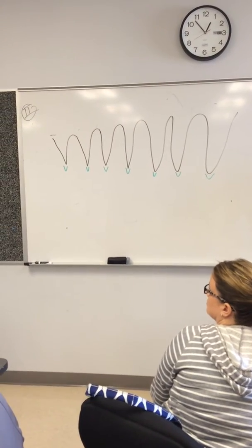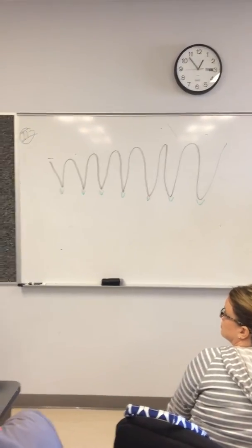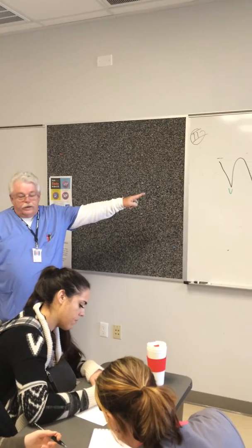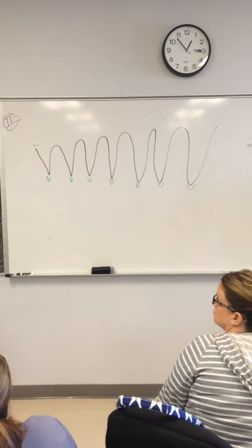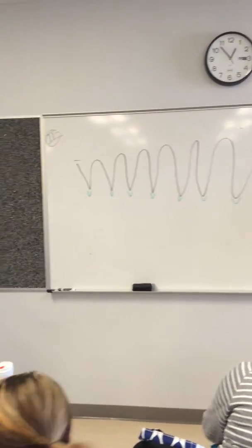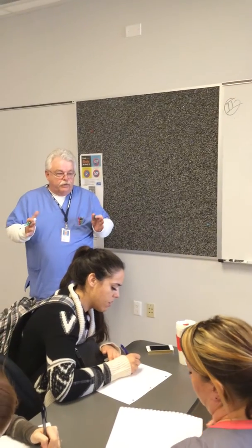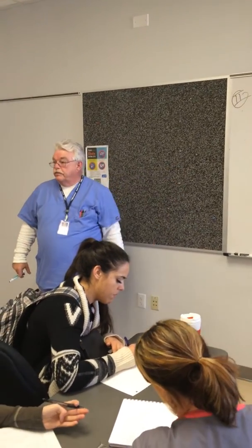Don't worry about the rate. It's going to be greater than 100. The books say it's got to be 150 to 180 or 250. It doesn't matter. If it looks like that on a 6 second rhythm strip, that's VTAC. Yeah, the rate can be 32,000 until the guy pops. Doesn't matter. It's greater than 100 because tachycardia, under any circumstances, by definition, is greater than 100, and it has those little God-given V's in there. That's VTAC.